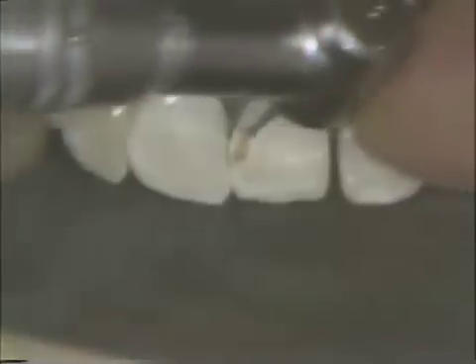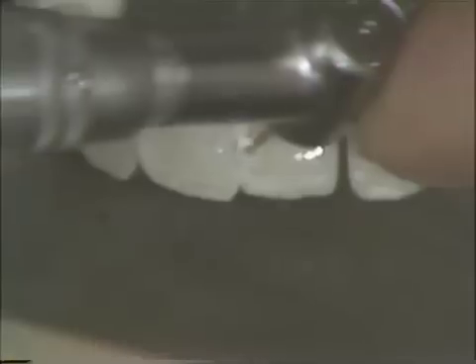Now, with the conventional speed and a number 2 round burr, notice the difference in the size of the burr. We will come in with conventional speed and slowly remove the rest of the carious lesion. Remembering we have arrived at what we think is a normal cavity preparation. Light touch, relatively high speed with this conventional speed. Again, on and off the tooth. We do not hold it on the tooth constantly. Notice that motion. It's of extreme importance in any cavity preparation.